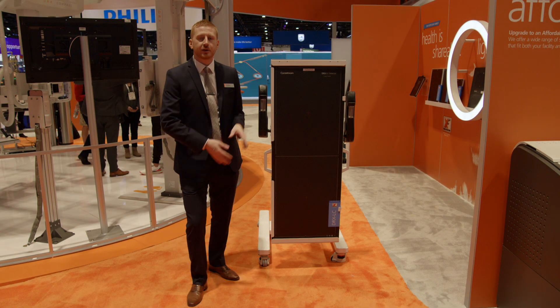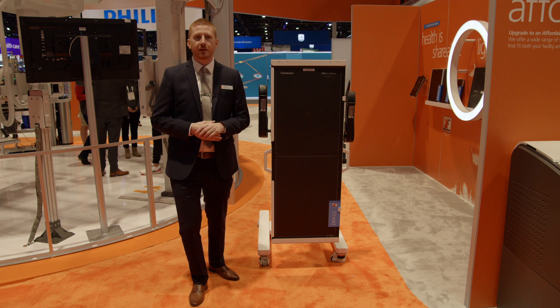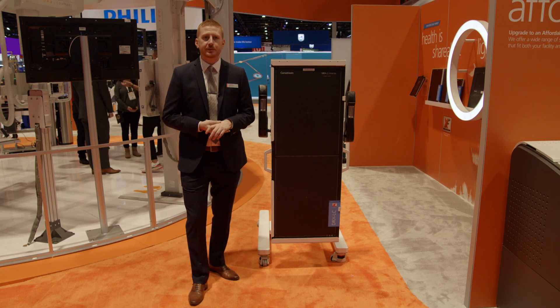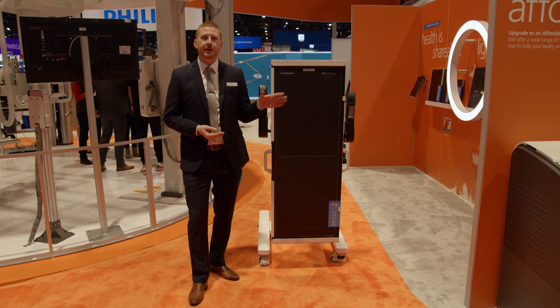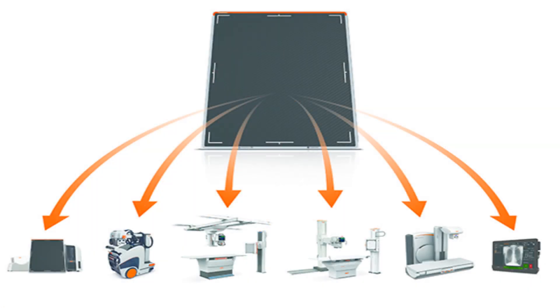The DRX-LC detector uses a cesium scintillator, is available in tethered and wireless options, and is available for our room and mobile systems. The DRX-LC, just like our DRX Plus family and our new Lux 35 detector, features CareStream's unique X-Factor, so these detectors can be shared easily across all DRX systems, allowing a facility to further leverage their detector investments.